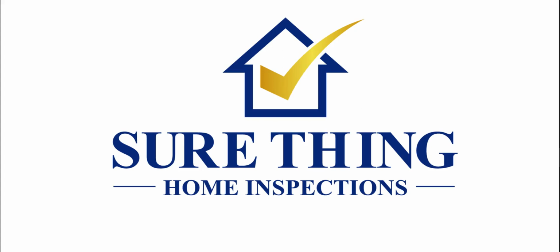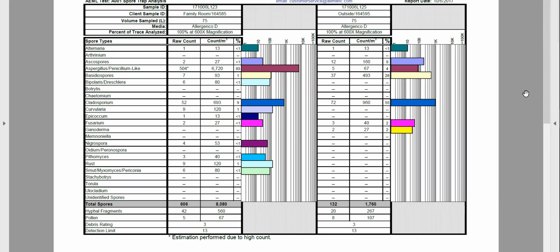Sure Thing Home Inspections here, showing you how to read an air quality mold test report that has been conducted by our company, either with a home inspection or for a separate mold inspection job. What you'll see here is the lab result grid sheet.